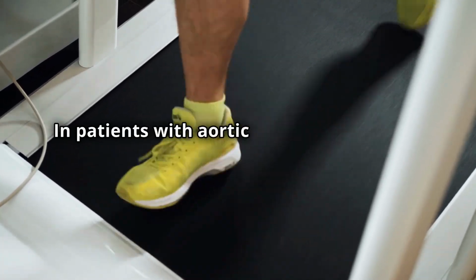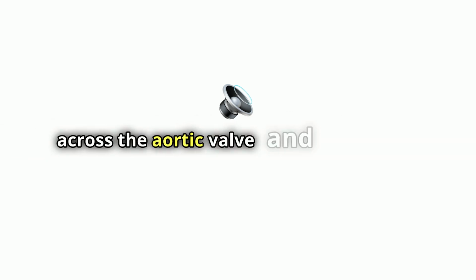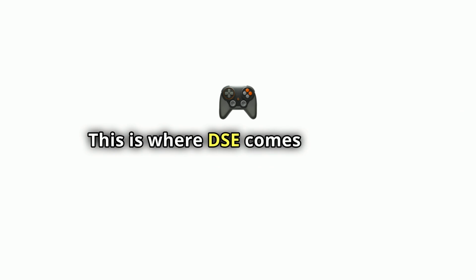In patients with aortic stenosis, especially those presenting with symptoms but showing a low mean gradient across the aortic valve and a low ejection fraction, it can be challenging to determine whether the stenosis is truly severe or if the low gradient is due to reduced cardiac output. This is where DSE comes into play.